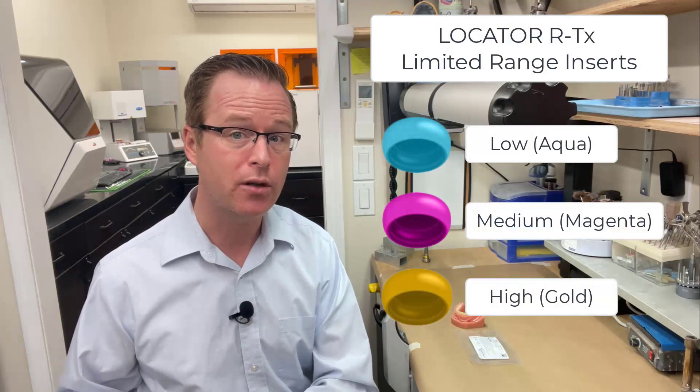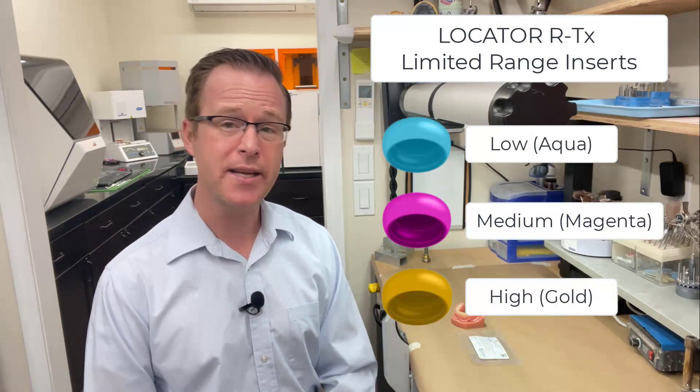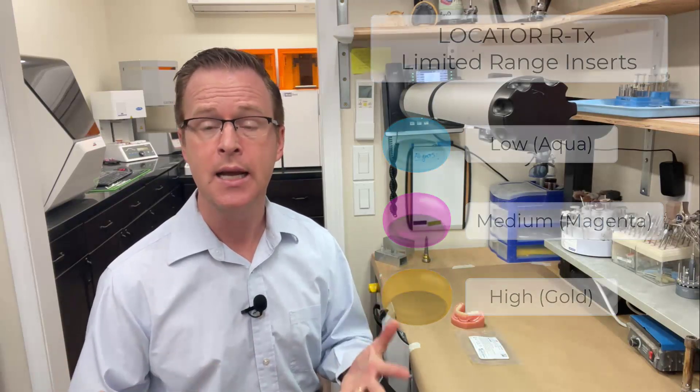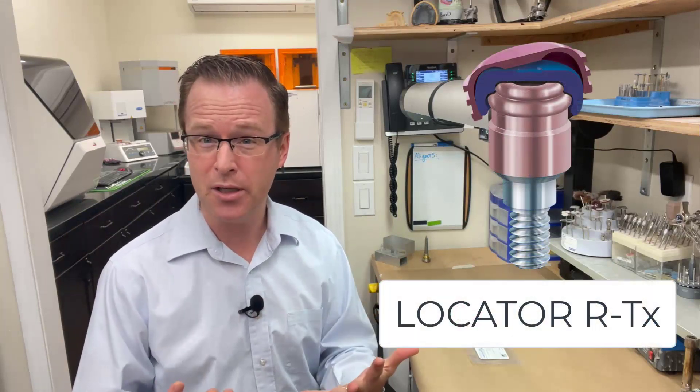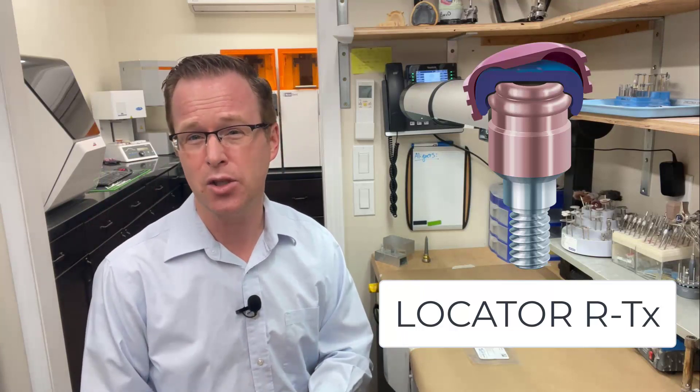Zestental Solutions has released a limited range insert for Locator RTX. Historically, Zestental Solutions with the Locator RTX product focused on numerous design improvements over the original legacy Locator, such as a pink titanium carbon nitride coating known as Duratec, a narrower path of placement, dual bumps on the outside, a retentive element that is very simple to use, housing with enhanced grooves, and an 050 hex driver.